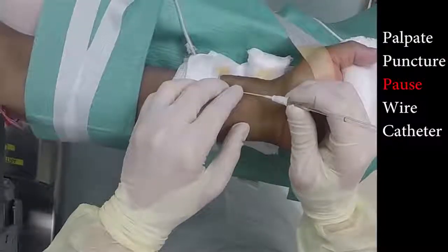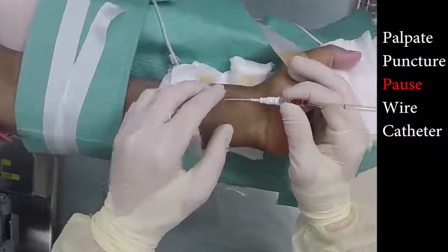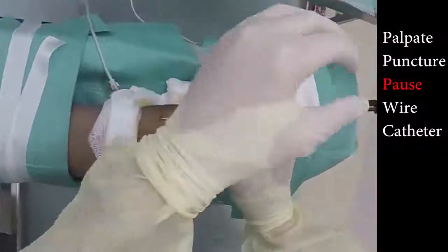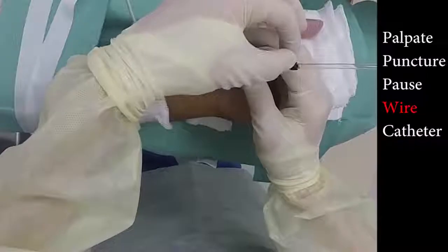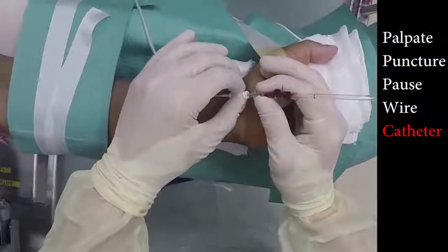Five points are located on the right side of the screen: palpation of the artery, puncture of the skin, pausing, which we will discuss later, threading the wire, and last, threading the catheter.